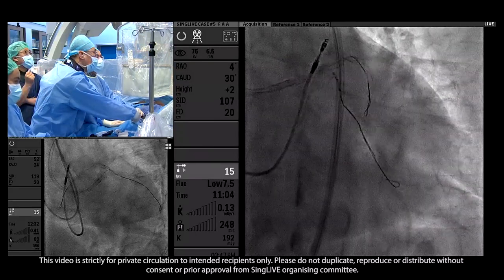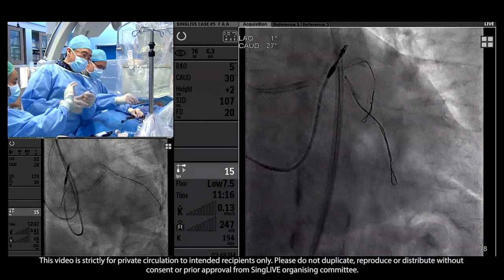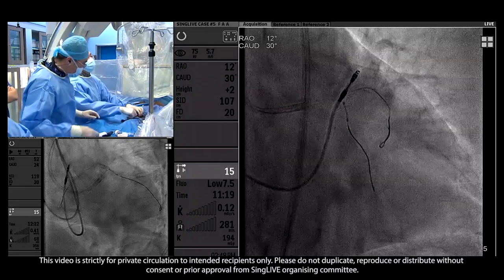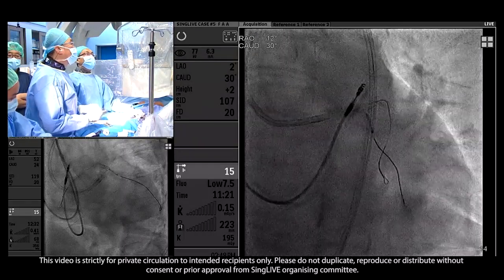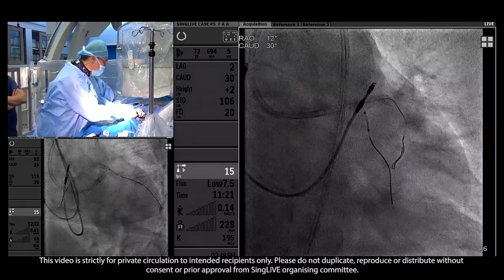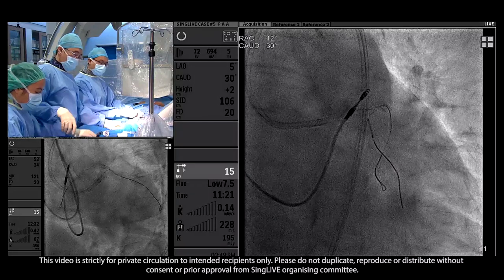You need a balloon in the left main, right? And don't forget to remove the wire. Yes, don't remove the wrong one. Thank you. Remove the wire. And then usually, for the TAP technique, we put another NC balloon in the LAD. LAD is 3.5 or 3. We have a 3.0 NC. 3.0 NC is good. Open another one for the LAD. Then match the circumflex ostium stent, and the implant would be much easier to perform the TAP technique.